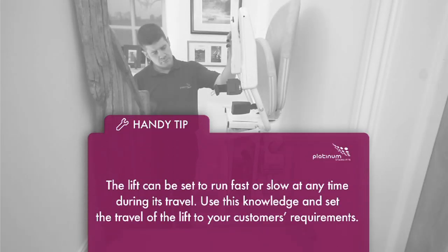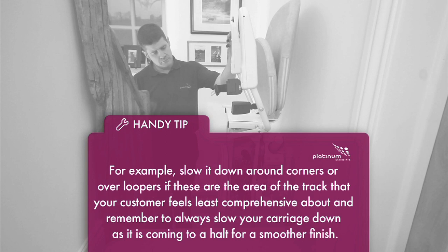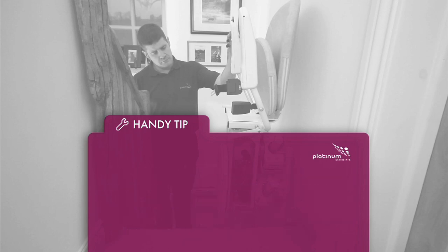Handy tip: The lift can be set to run fast or slow at any time during its travel. For example, use this knowledge and set the travel of the lift to your customer's requirements. For example, slow it down around corners or over loopers if these are the areas of the track that your customer feels least comprehensive about. And remember to always slow the carriage down as it's coming to a halt for a smoother finish.